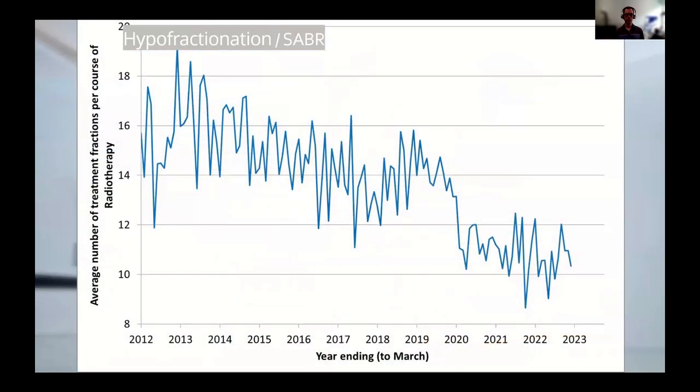As well as the dose conformity improving, this has allowed us, in tandem again with IGRT evolution, to increasingly hypofractionate patients. That previous slide showed a few trials, UK ones that have expanded hypofractionation. This is real data from my centre. So for Linacs, and we treat all sites really, we just don't do SRS. Until about 2020, we were around 15 fractions for each treatment course. In 2020, we introduced 5 fraction breasts. That's that big drop in 2020. And then more recently, we've increasingly done SABR or SBRT for lung and oligomets as well.